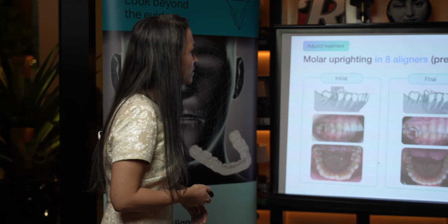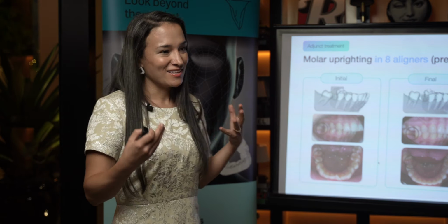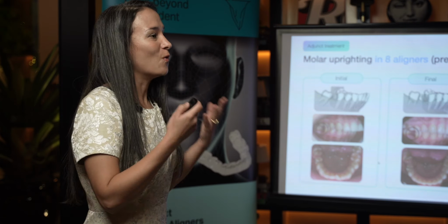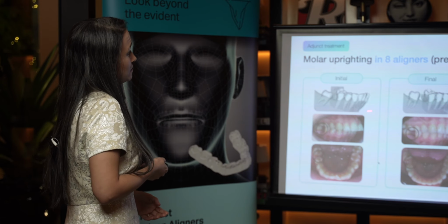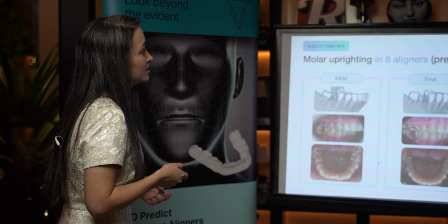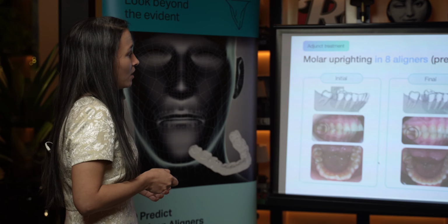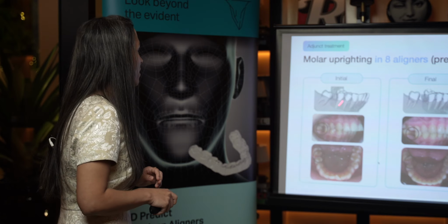And it also doesn't feel good because, once again, we have been ingrained in dental school. It's healthy enamel. Why are we touching it? Why are we violating this tooth? And the only reason why we're doing it is because we're making space for the implant. Otherwise, we wouldn't be doing it. Now you can have a different conversation with your patient and say, look, in 4 months, we can open that space with aligners. And we don't have to touch the tooth.